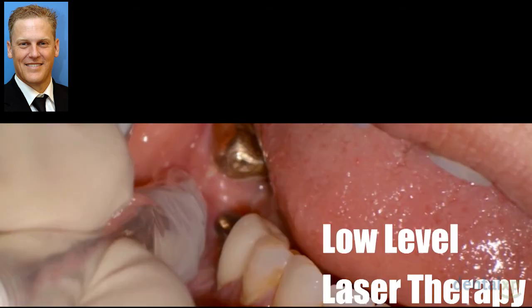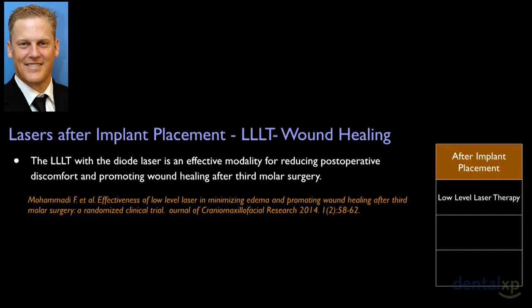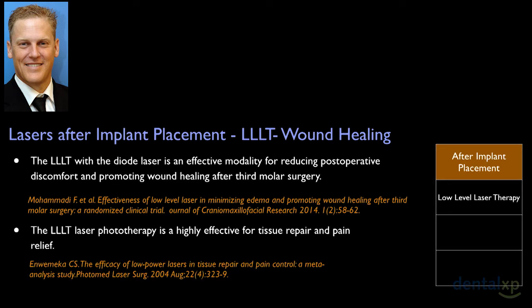One of the exciting things that's happening with all lasers is low-level laser therapy. The diodes that so many of you own can be used at very low settings to improve wound healing. There are studies that show now in the last 3 to 5 years that a diode laser used at low settings can be an effective modality for reducing postoperative discomfort and promotion of wound healing. It is also effective for tissue repair and for pain relief.